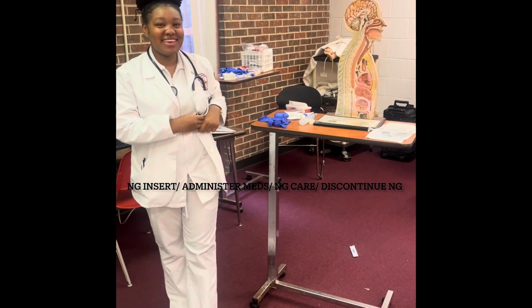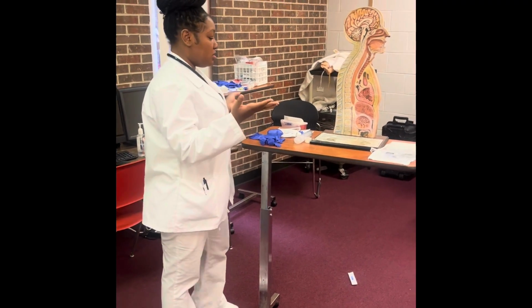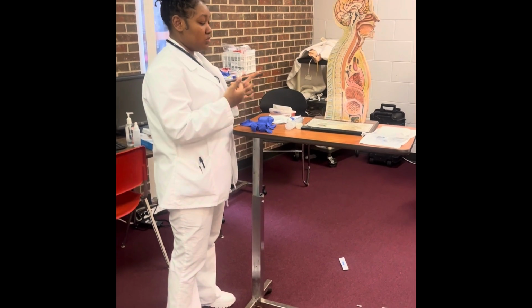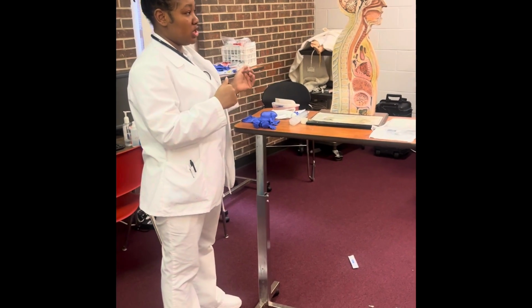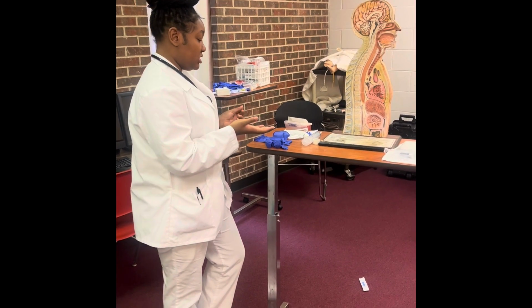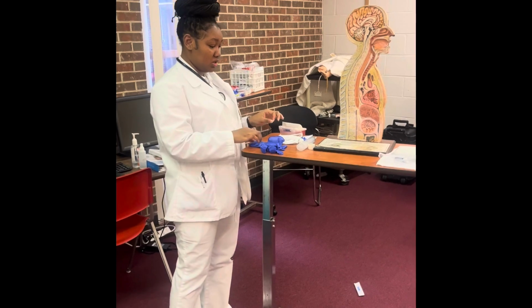Hi, my name is Checkoff. I'm a Tuskegee University nursing student. Can I please have your name and date of birth? Thank you. And I'll also do a second identifier like a wristband or a MAR. Today I'm here to insert an NG tube, do some routine care, give you some medications by the NG tube, and discontinue it. So before I start, I would do hand hygiene and put on some clean gloves.